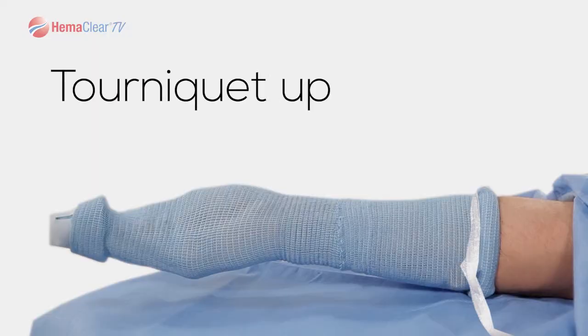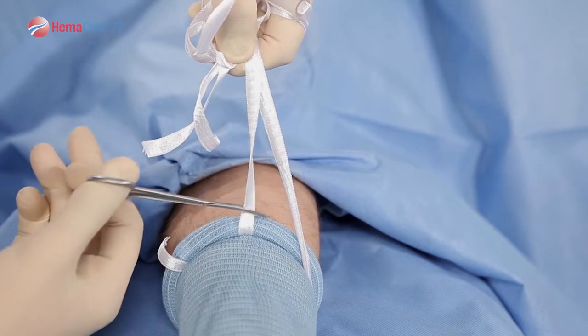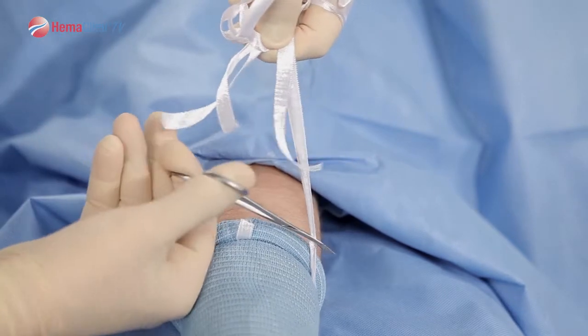The tourniquet is now up. Dictate the tourniquet time. Once Hemoclear has reached the desired occlusion location and tourniquet time has been recorded, simply cut the ribbons off.